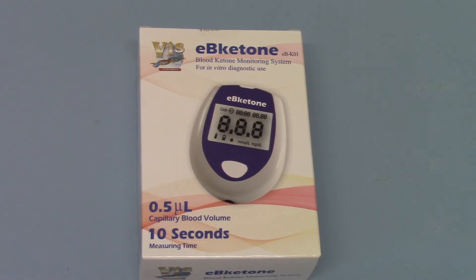This is the meter for you if you don't like the idea of having to finger prick yourself. Also on the packet you'll see the 10 second measuring time. Again, that's fast for a keto meter. It gives you a good reading quickly on a small drop of blood, and that's basically what it's all about.